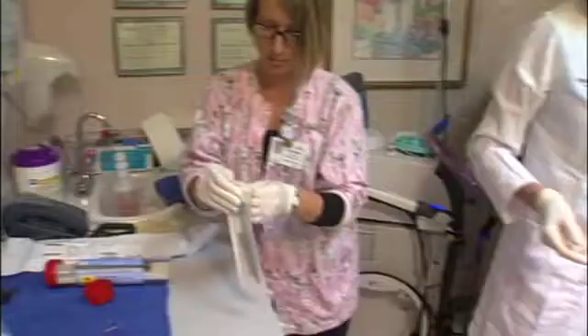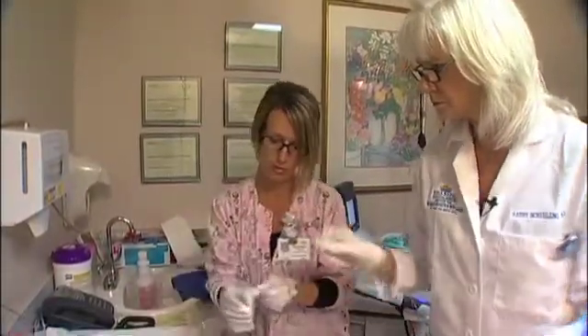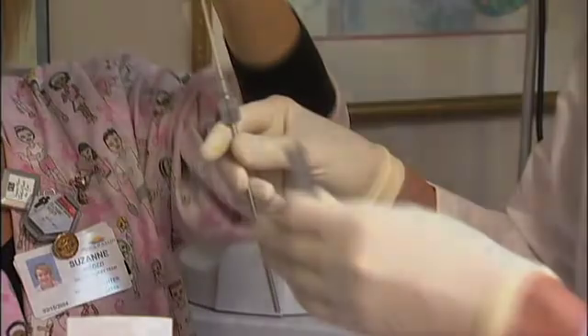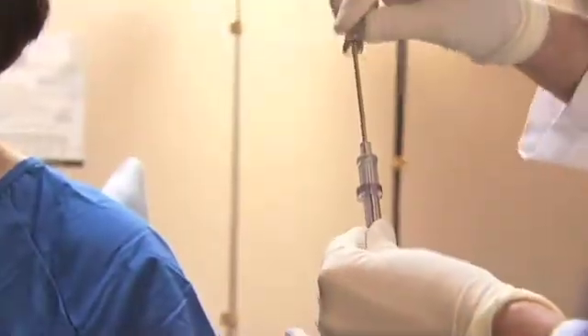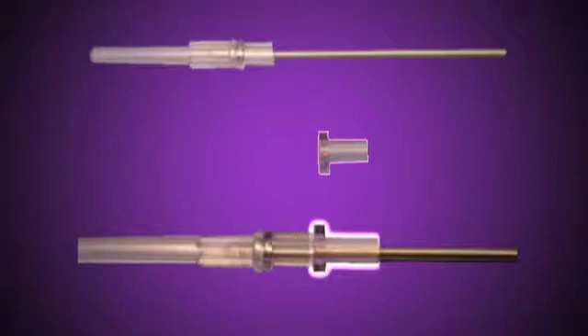With sterile gloved hands, remove the sterile line source casing from the package. A technologist then inserts the non-sterile radioactive germanium PET line source into the line source casing. Next, continuing to wear sterile gloves, attach the sterile casing handle to completely encapsulate the radioactive source. Place the Mamatome probe guide spacer piece onto the proximal end of the line source casing. If the probe guide spacer is not used, the line source casing will be too long and will not accurately locate the biopsy aperture with the lesion.